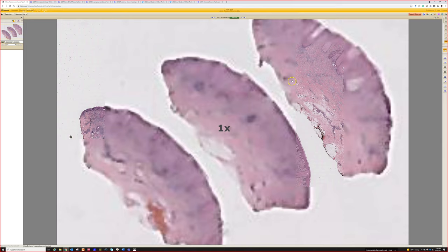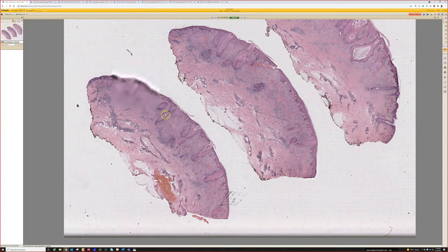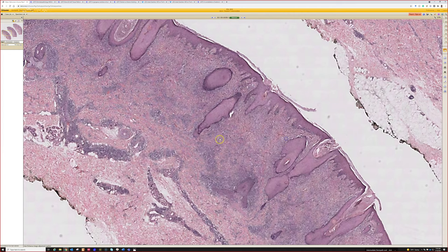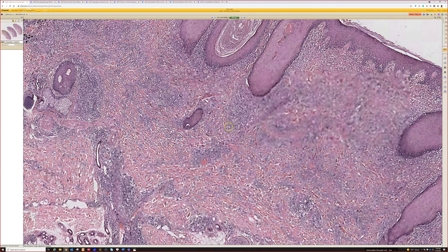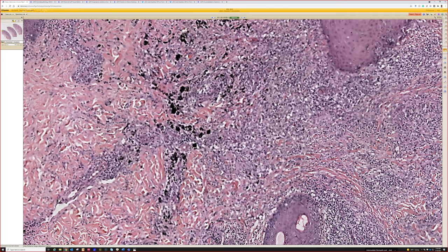Case five. Right away it looks like the action is in the dermis — there's a pretty brisk infiltrate. Going in closer, there are small blue cells. And then that looks like some foreign pigment — it's too dark and too clumped for anything the body would make. So that looks foreign, likely tattoo. Surrounding that, it looks like a mixed lymphohistiocytic infiltrate.